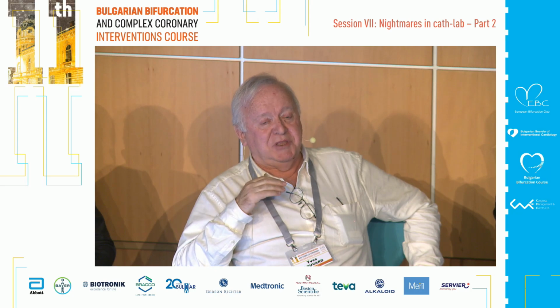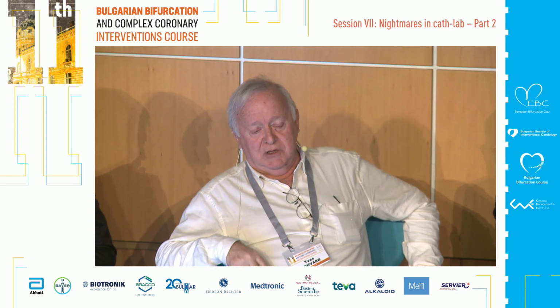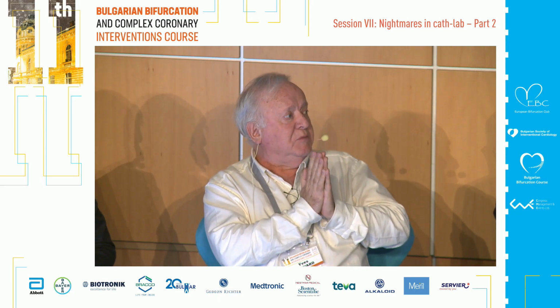So in my opinion, you have not only the vessels here, you also have nerves. And you have to take care not to deliver a lot of coils. What you did is much more limited.